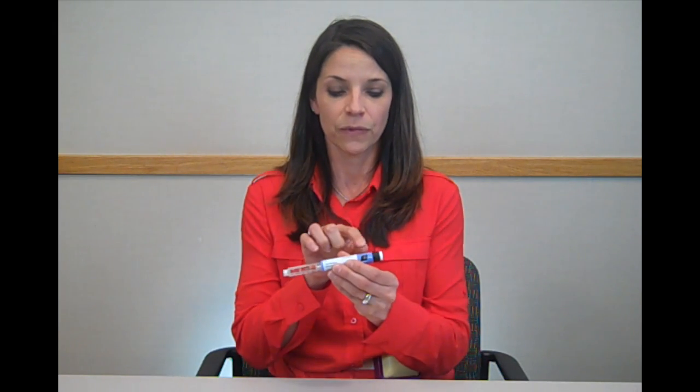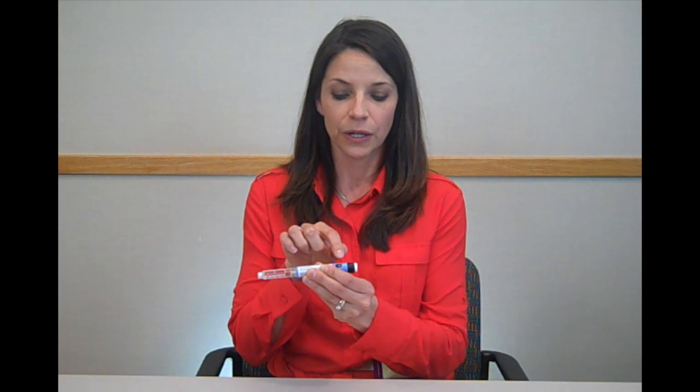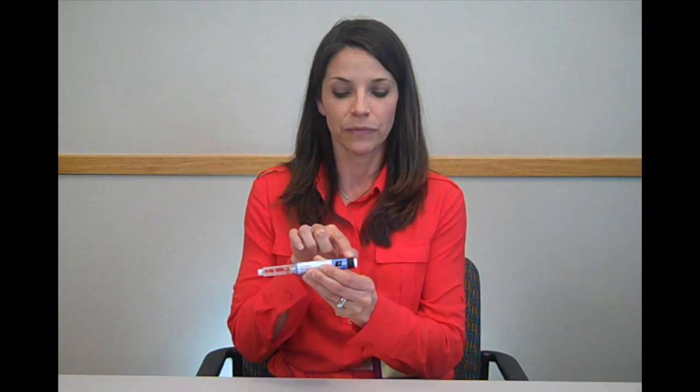Your Victoza pen has several parts. It has the pen cap, the rubber stopper, the cartridge, the dose window, the dose pointer, the dose selector, and the dose knob.